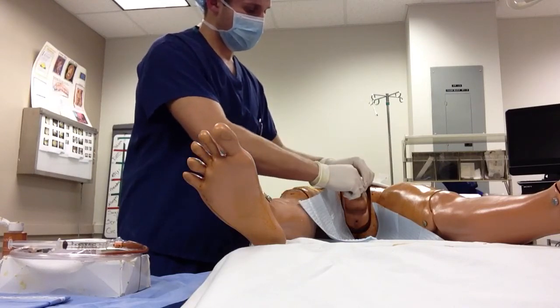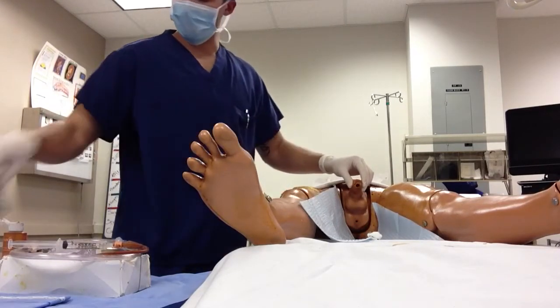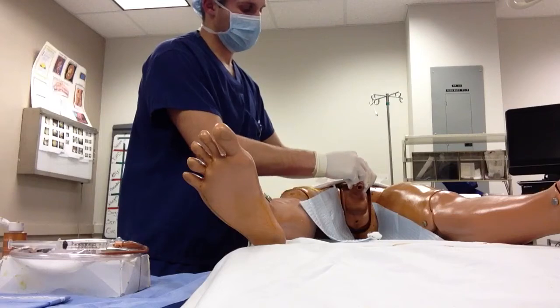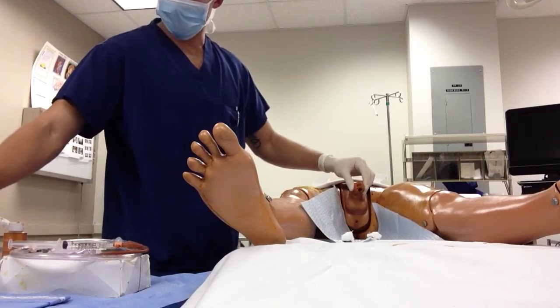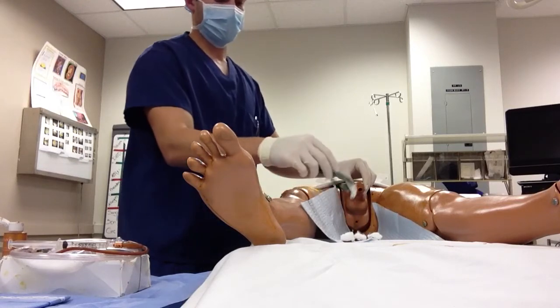Circle the glans, get the urethra, and dispose of the cotton ball. Keeping grip, go back and get another cotton ball, repeat — around the glans, over the urethra, and dispose. One last time: around the glans, over the urethra, and discard. This cleaning is performed three times total.